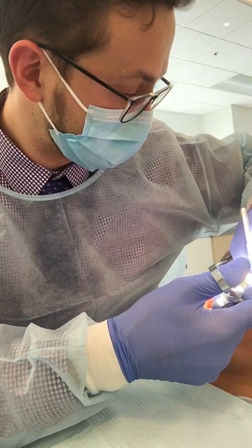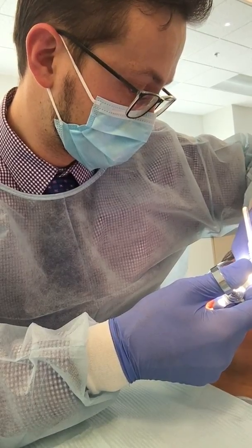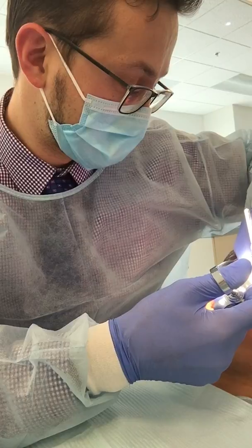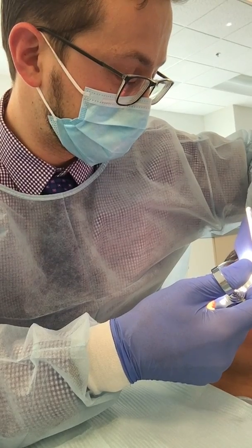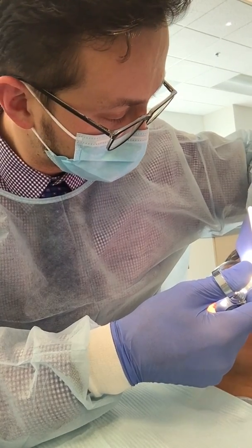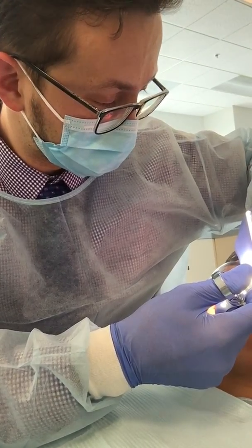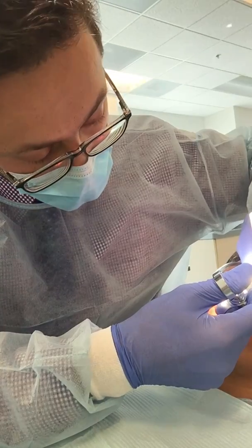You're doing great. Yeah. Just a little bit more. You're about halfway where you want to go. Yeah. So now you can probably speed it up just there. Yeah. That looks good, and we are good and I'm coming out.